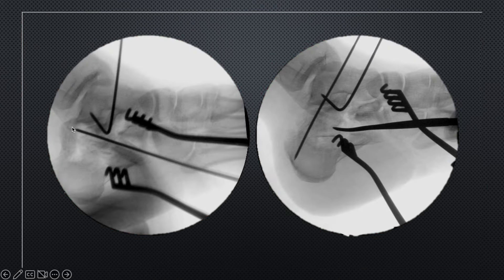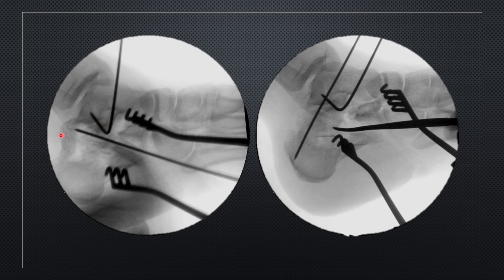When we go through the sinus tarsi approach we expose this part. You can simply pass a k-wire through the displaced posterior facet fragment so that you can joystick that fragment into the joint and fine-tune its reduction. We have placed the k-wire in that particular fragment — see how unstable it is, almost moving outside the joint. Therefore open reduction is important in this scenario. First, since the medial fragment was very well in line with the talus, you can restore the relationship of the tuberosity with this fragment. Just forget about the displaced lateral fragment for now — restore the alignment of the tuberosity with the remaining part of the posterior facet and the talus, which will give you a template for stabilization of the displaced fragment.